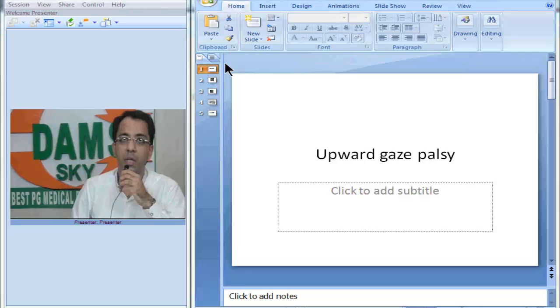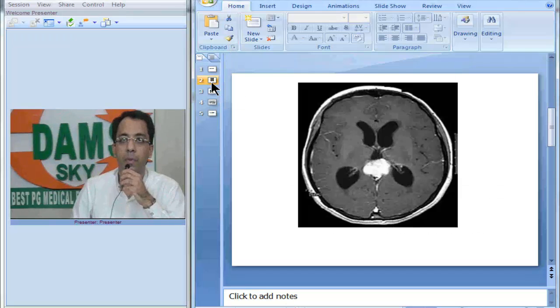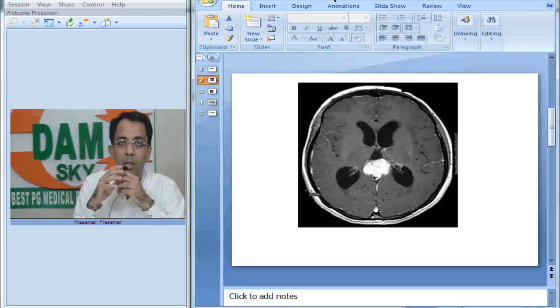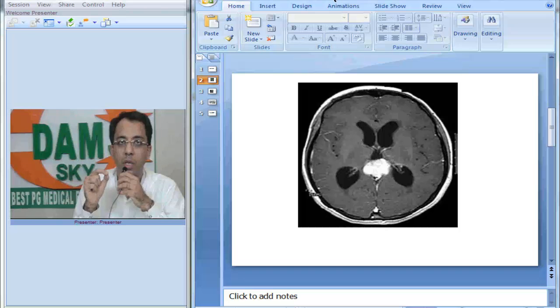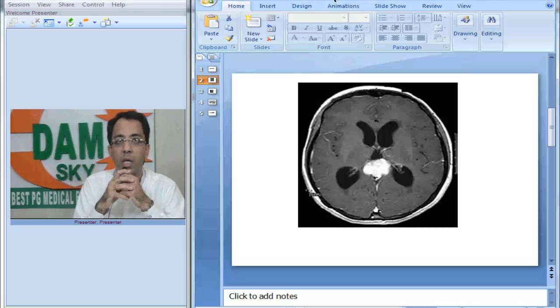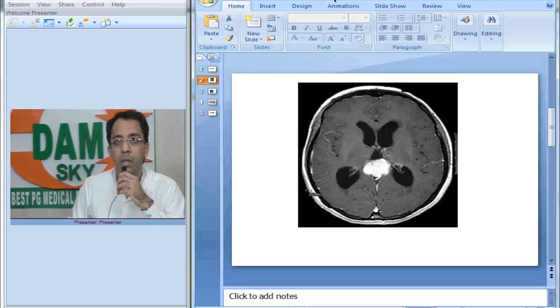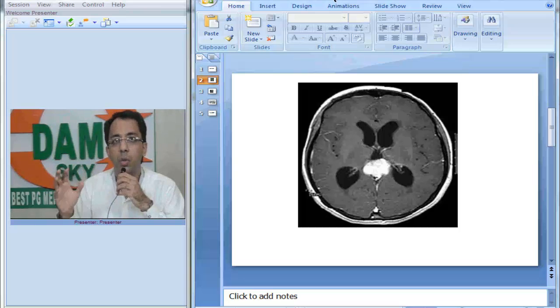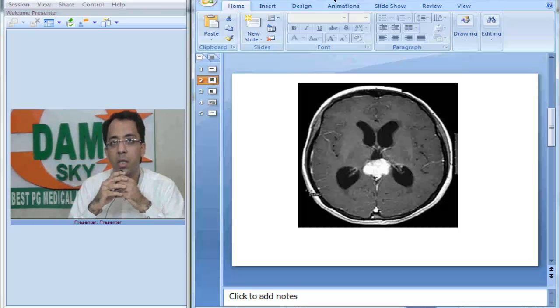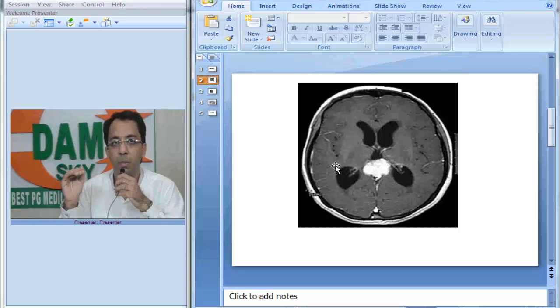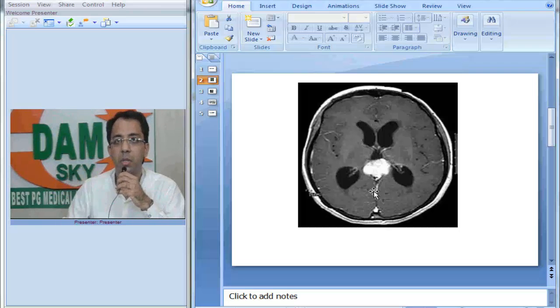This child has upward gaze palsy and this is an axial post-contrast MRI image which was done after gadolinium administration. Let us get oriented to this image and see how to evaluate this case. This is a T1-weighted post-contrast MRI image.